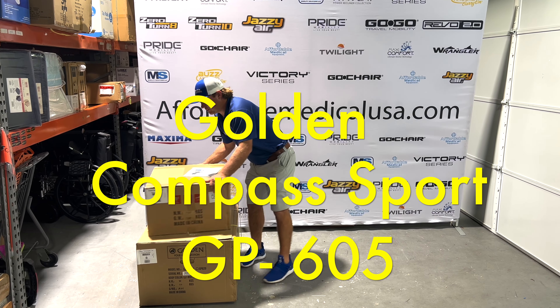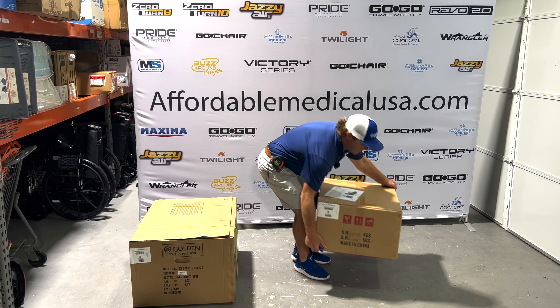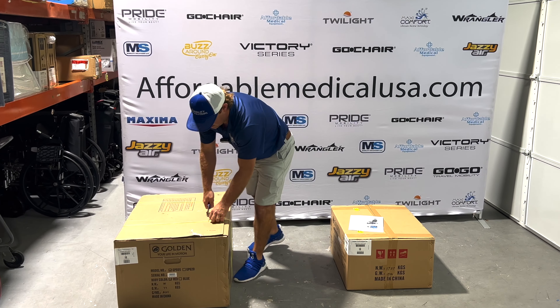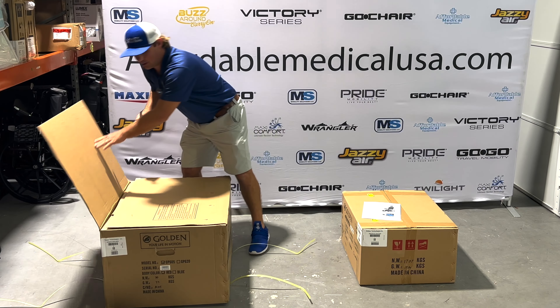The first thing I'm going to do is just move this seat right off and put it to the side. This unit comes in red or blue. The Compass Sport has been out a while, but this is the redesign of it, so we're pretty excited about it.